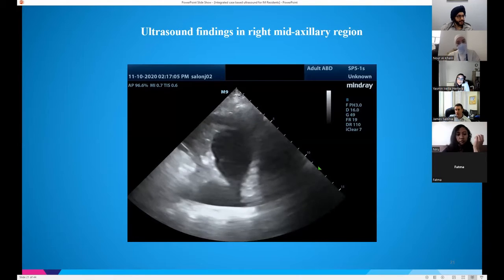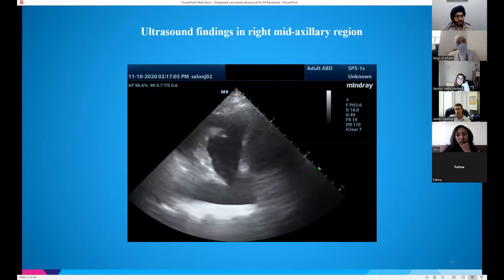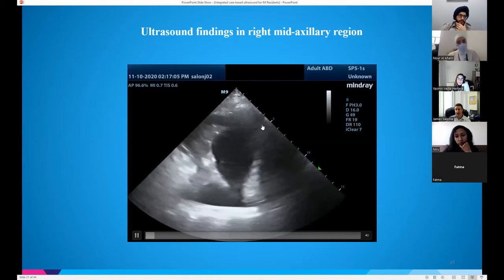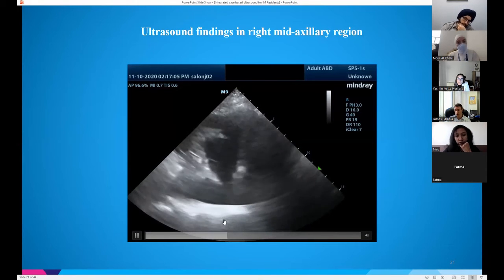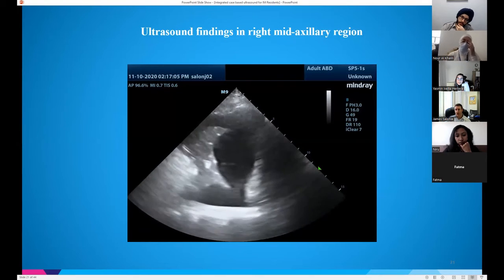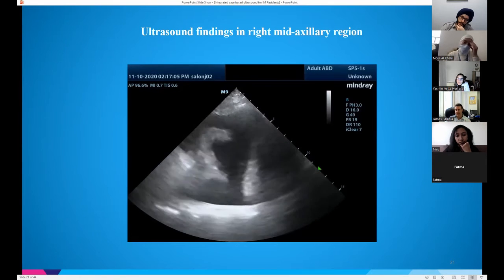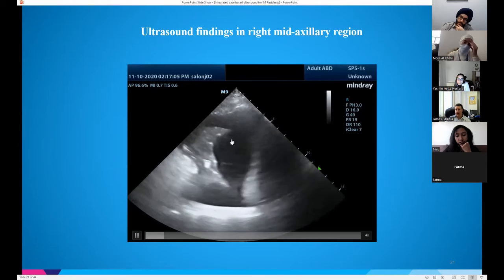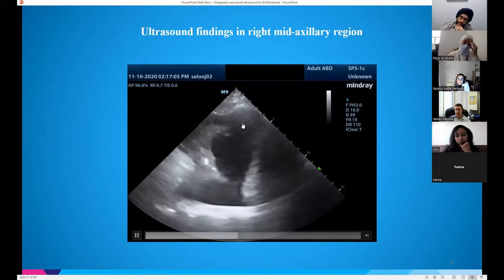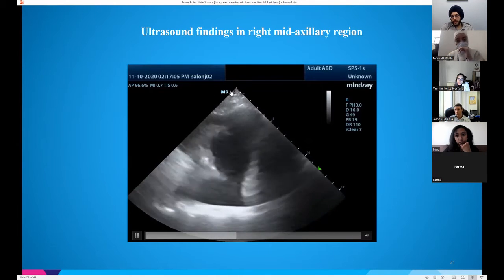Very, very small window. So less than 2 centimeters, you're really pushing yourself because you don't have a lot of room to maneuver before you could hit the lung and cause a pneumothorax, or hit the diaphragm, even worse, and cause even more problems, right? So it really depends on how important this test is as well. So you can do it if you needed to, but I would be very, very hesitant unless I absolutely had to. And exactly how Yaz was saying, you want to look at the depth and the size. So not just the size of the effusion, but what's my safe distance? How much distance do I need to go before I get to the effusion? So I want to look at 1, 2, about 2.5 centimeters before I know I'm in there.